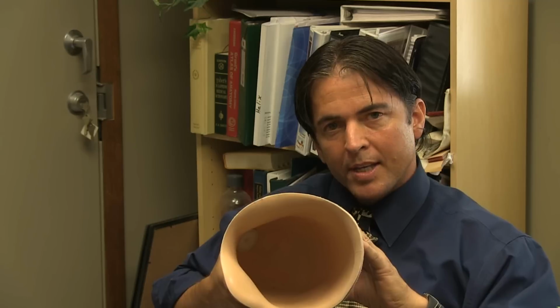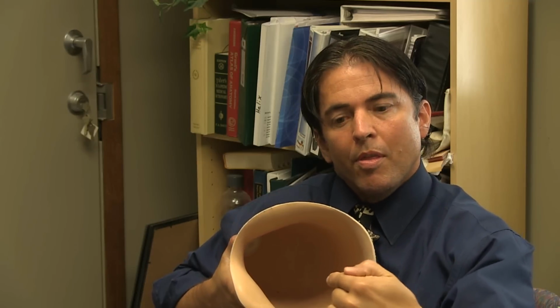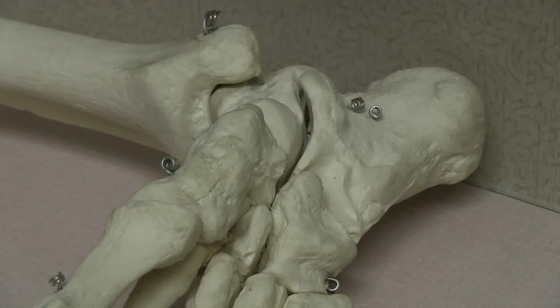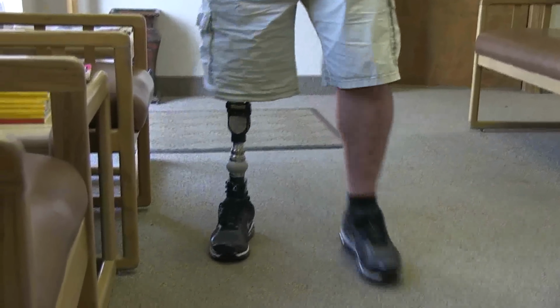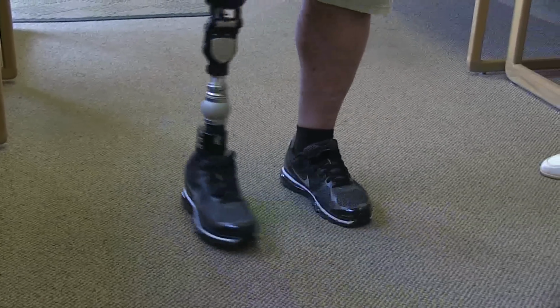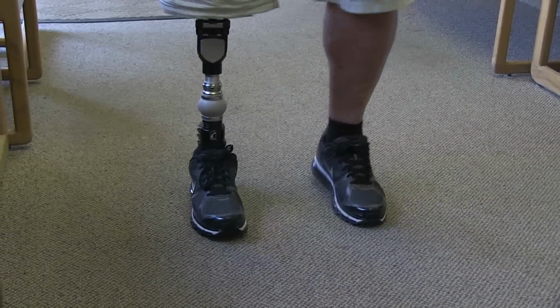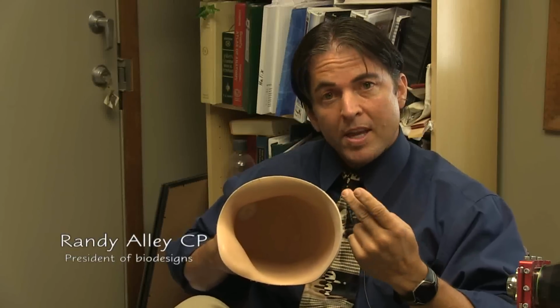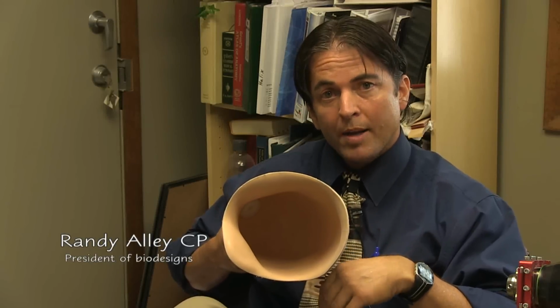The problem with that is the femur, the bone inside that limb, is able to move around far too easily inside the socket. So a person is losing energy as they ambulate. The moment they start moving, what actually moves first is the bone inside the socket. And then the prosthesis responds, making the prosthesis feel uncomfortable, heavy, and they use a lot more energy to walk.